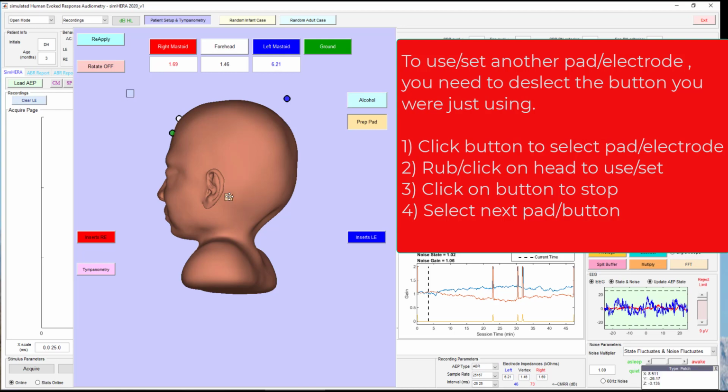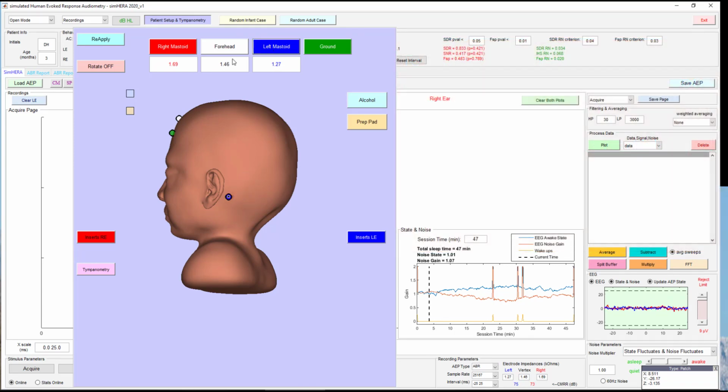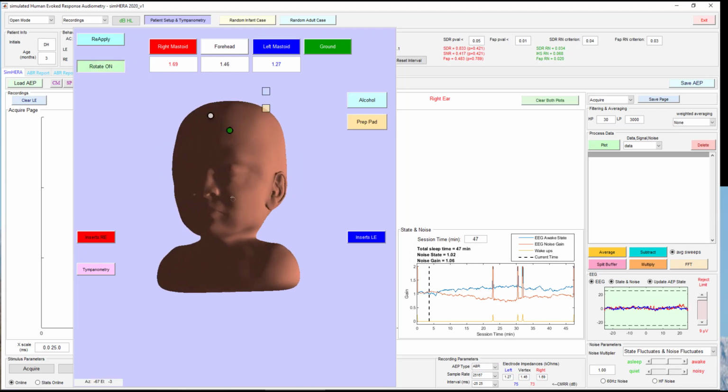So there again, prepping the area, and then click on left mastoid, and then place it, and then we'll go ahead and we can actually move it, and if you look down at the EEG on the right, that is showing that it goes from a noisier EEG to a quieter EEG.